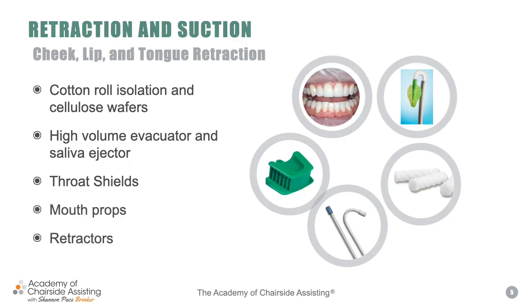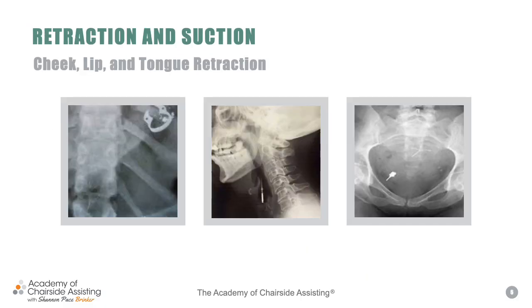The one thing that we want to mention today is, why are we utilizing so many products and materials to help with retraction? Well, the most important reason is because we know that in dentistry, there's always going to be accidents and things are going to happen. We're all human and we have no control over everything, although we wish we could, right?